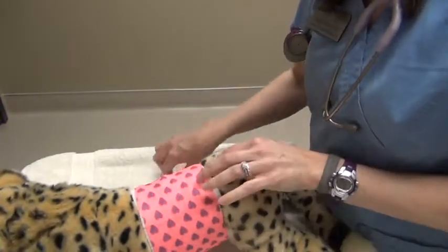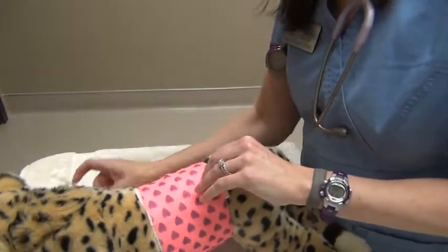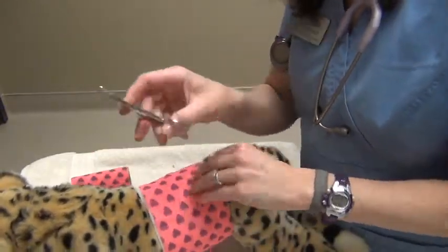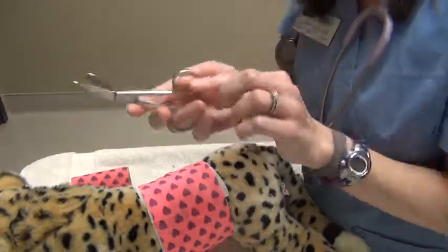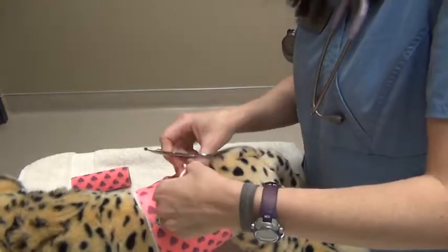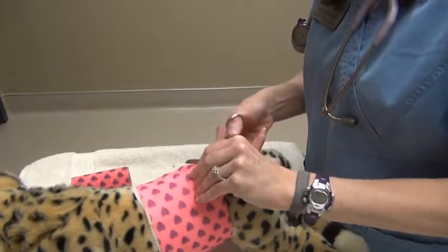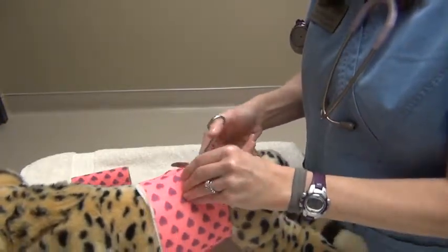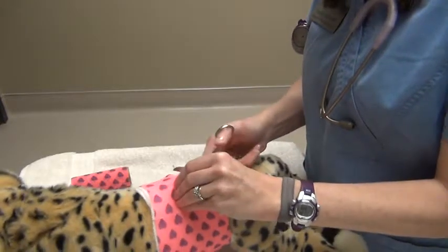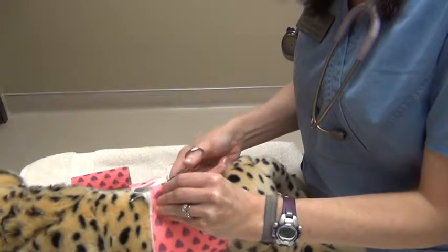Don't put your scissors where you can't see. Because our patient has a wound down there, I don't want to go anywhere near a wound or anything I can't see with scissors. I'm just going to use some simple bandage scissors, and I'm going to cut along the top. I'm going to make sure I have all the layers isolated in my finger before I start to remove this bandage. So I'm going to gently cut, just checking the depth of where my scissors are, making sure I'm not hitting anything vital. Just very basically cutting this off.